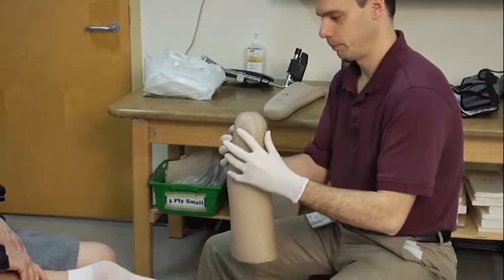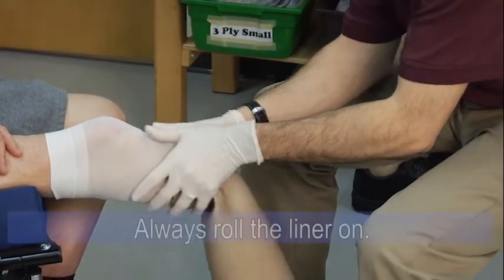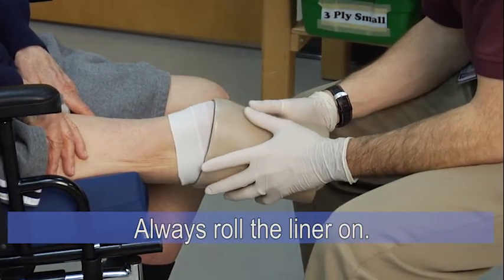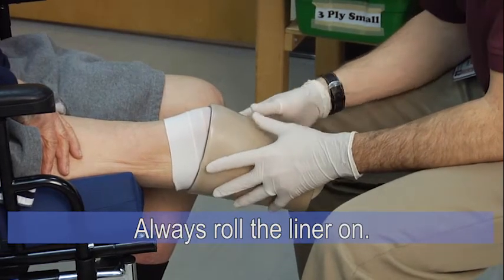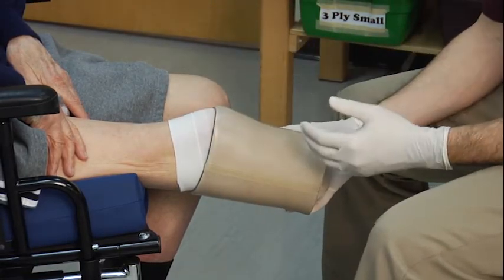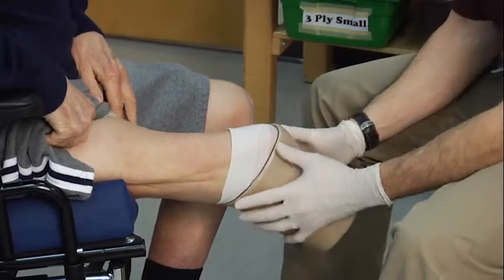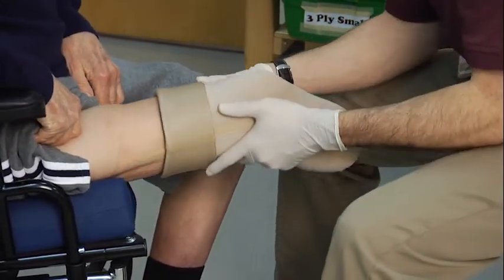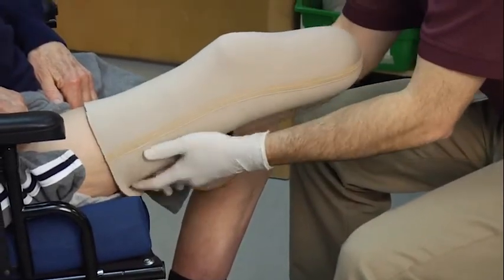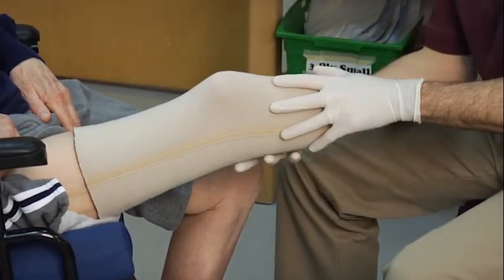I'm then going to help put the gel liner on — applying it to the end of the limb and gently rolling it onto his leg. I want to ensure that I roll the liner completely up and not pull it on the skin, as it will create shear forces onto the skin. I'm going to have my patient move to the edge of the seat so that I can apply the liner all the way up to the top of his leg. I'll check to make sure there are no creases or wrinkles and that the liner is completely smooth.